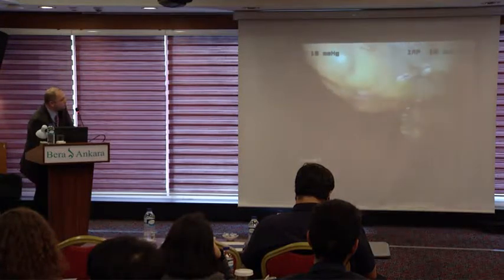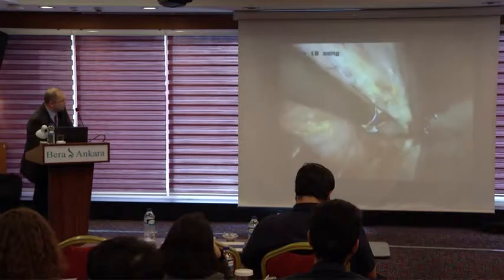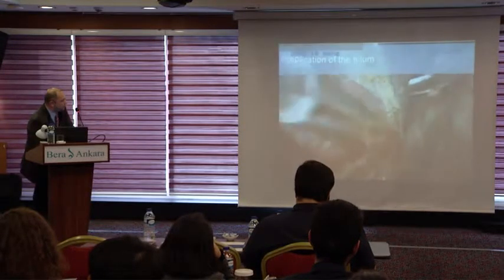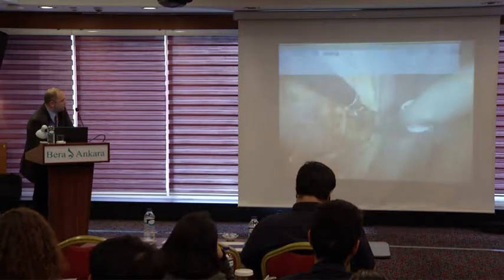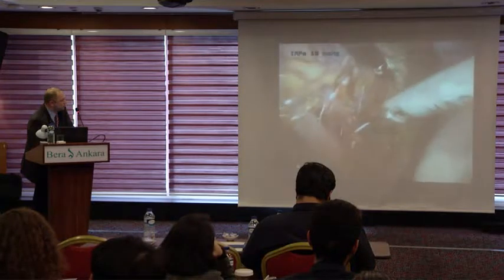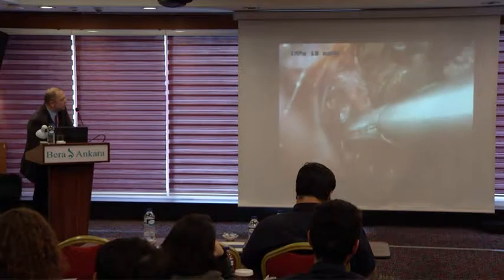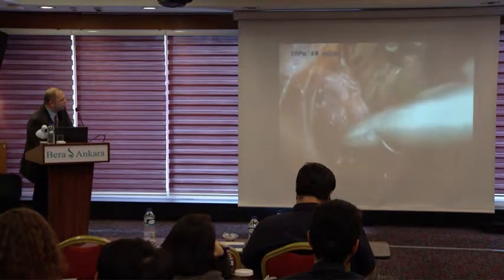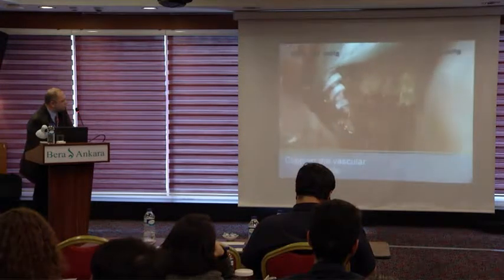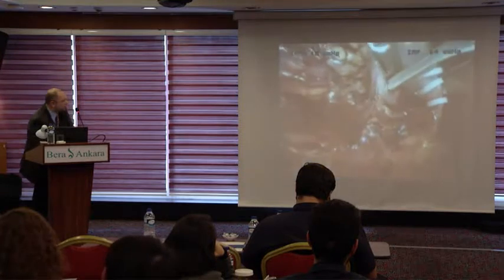After dissection of the upper part of the kidney, the renal pedicle can be dissected. First, the renal vein is visualized and behind it the artery is found. Using fine dissection, we individualize the different vessels and create enough space to use Hem-o-lok clips to secure both the artery and the vein. Now the clipping of the vascular pedicle.